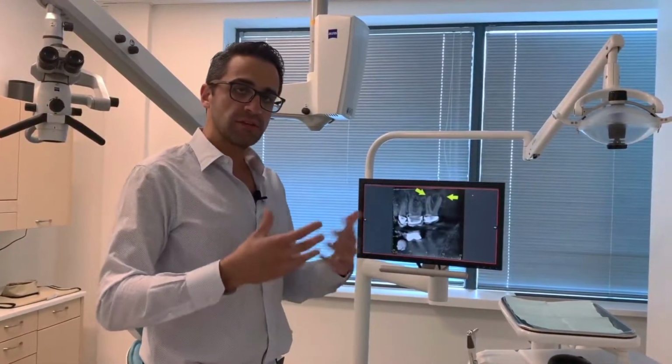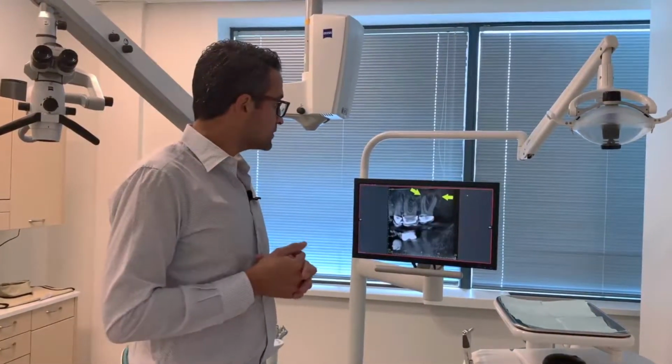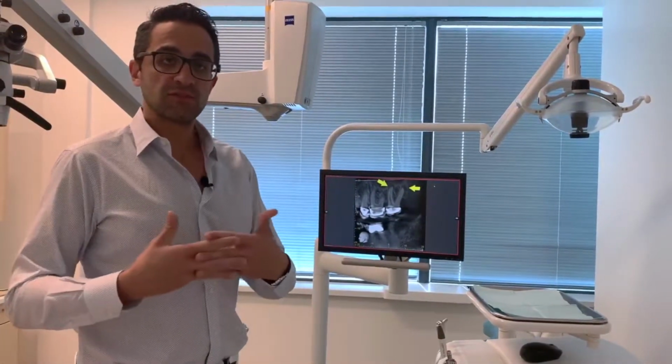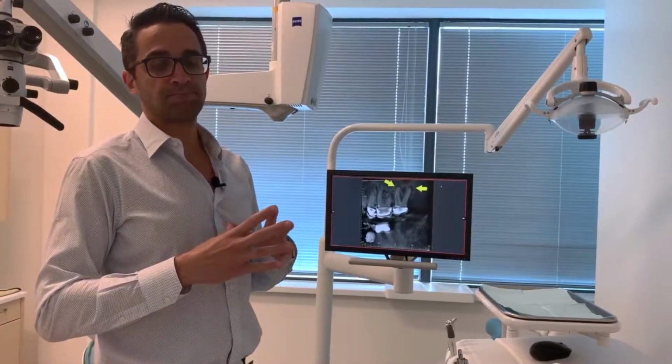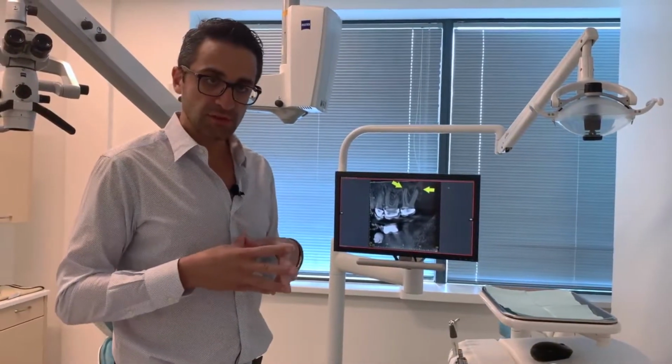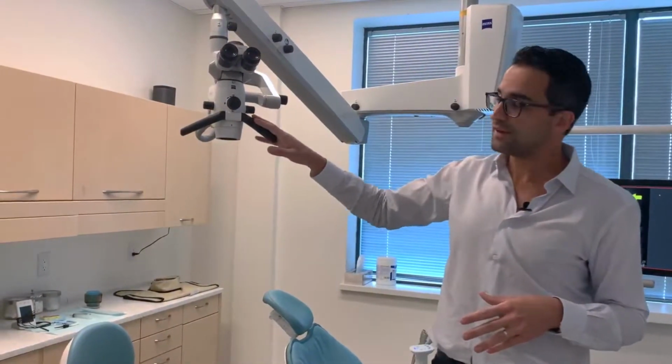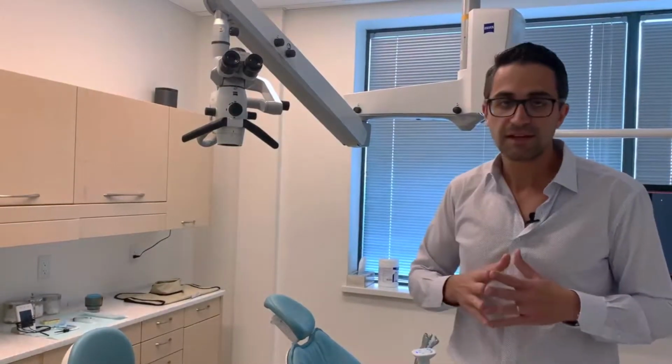So the patient agreed to do a root canal treatment on the tooth, since this is the tooth that is problematic. And while I was doing the root canal treatment, after accessing the tooth and inspecting it using a dental operating microscope, which is this guy right here, which is going to identify himself by lighting a couple of times various colors of the rainbow.